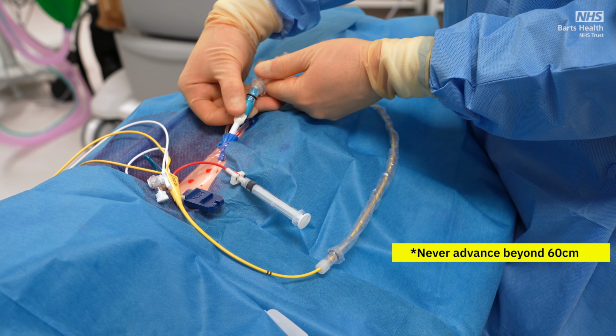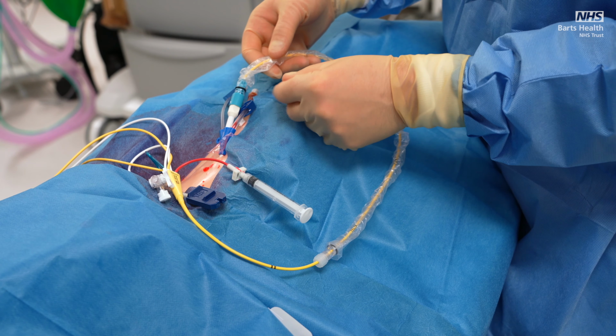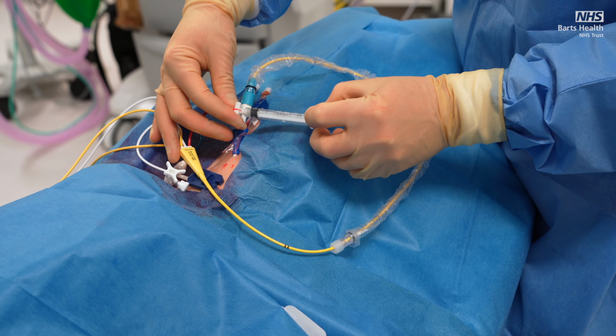Never advance a PA catheter beyond 60 centimeters. If you find that you have not found the ventricle at this point, withdraw the catheter with the balloon deflated and reattempt.